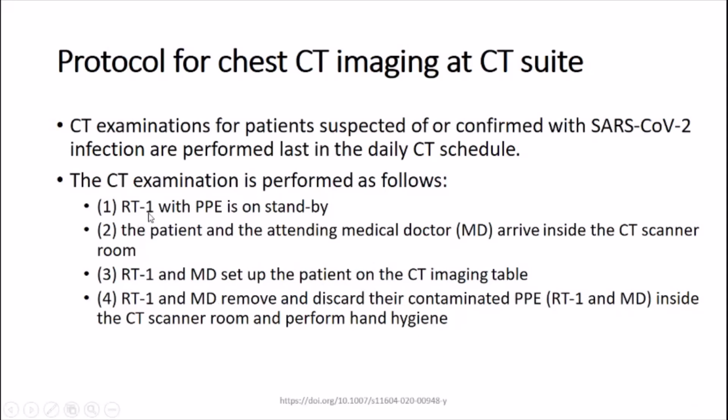Technologist number one will wear his PPE and will stay in the CT scanner room on standby. The patient with the attending medical doctor will arrive inside the CT scanner room. The doctor will be wearing, of course, his PPE. Technologist number one and the MD will set up the patient on the CT imaging table.